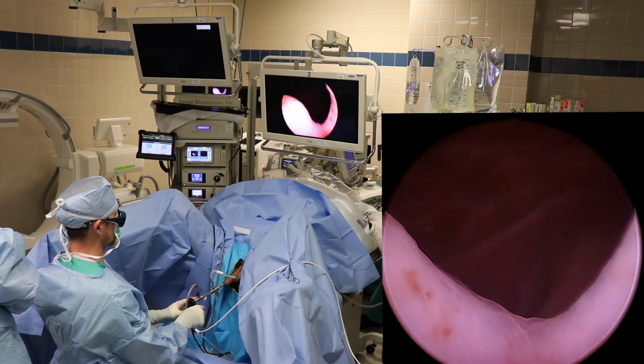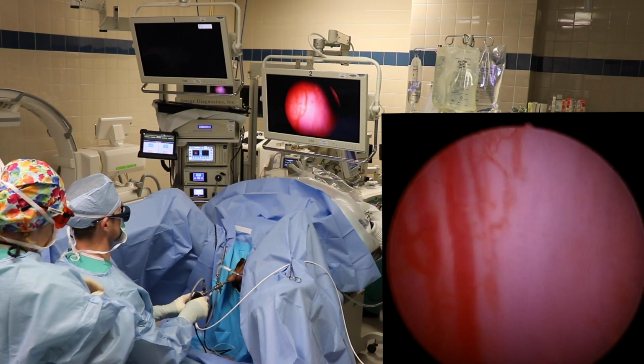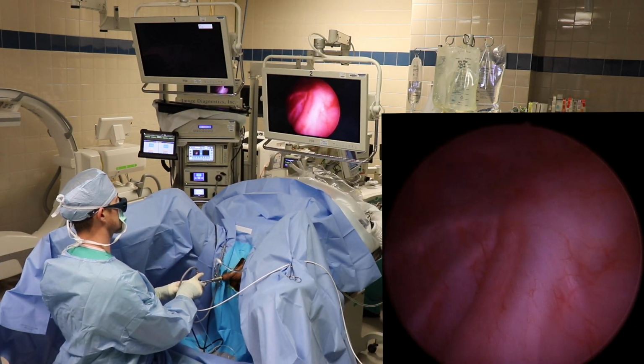Here you can see live video footage of the operating room. The picture-in-picture in the bottom right-hand portion of the screen is the picture that I can see on the monitor equipment when I am performing the procedure.